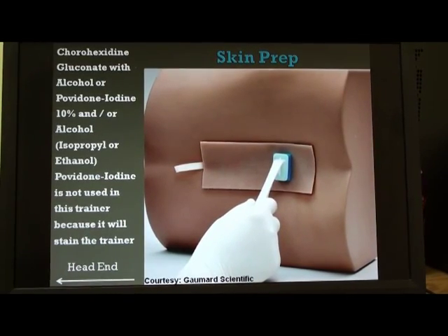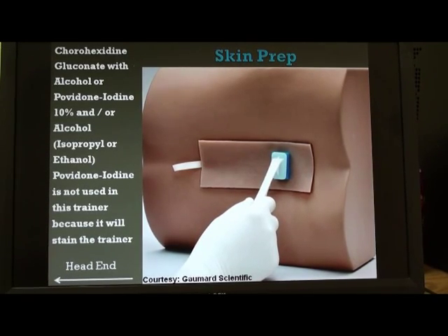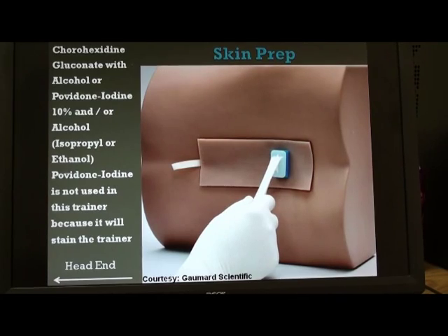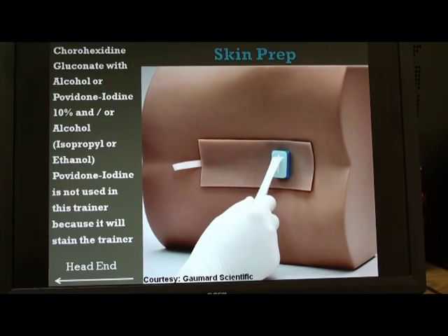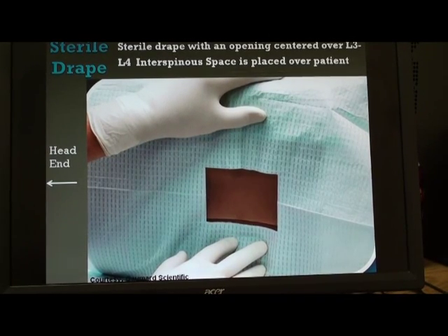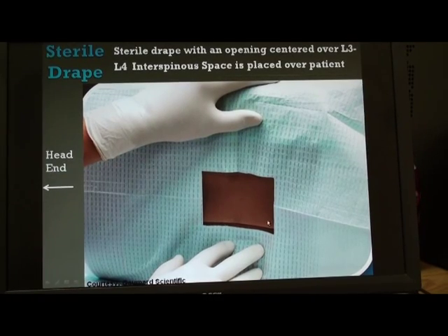We clean the area with antiseptic solution. We can use povidone iodine 0.5% or 10% (betadine), isopropyl alcohol, ethyl alcohol, chlorhexidine gluconate, or various combinations. In this particular trainer, we do not use povidone iodine or betadine because it will stain the trainer, but antiseptic preparation is important. The next step is to apply a sterile drape with a square or central circular opening centered over the site of the lumbar puncture.